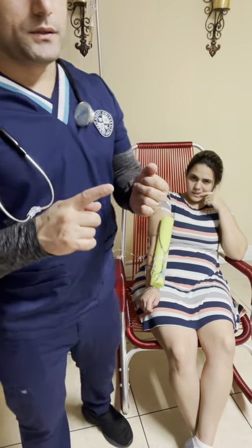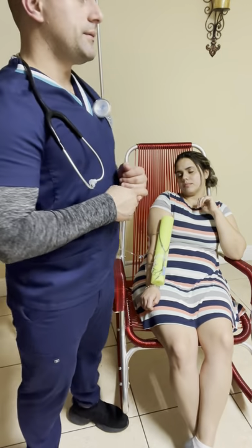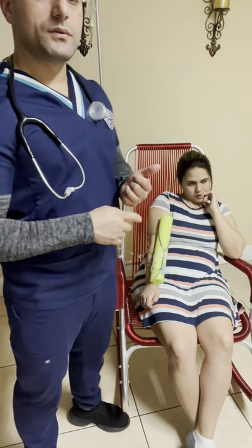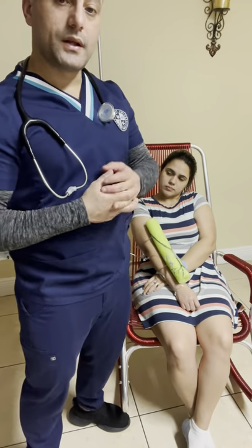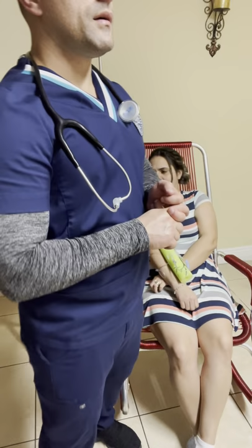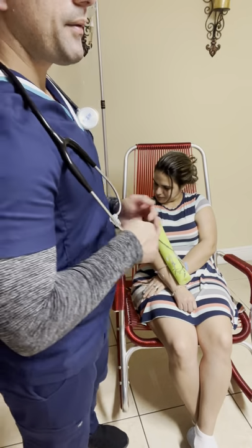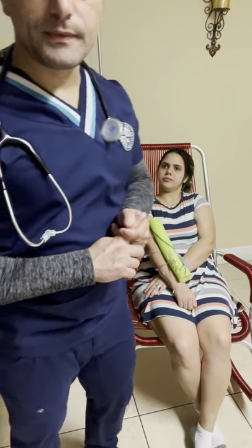Then I have to document all the procedures following the facility guideline. I have to document the IV assessment and the solution that I gave to the patient. I have to assess if the patient tolerated the procedure well. I have to document the drop rate, and the exact time and date. That was all. Thank you.